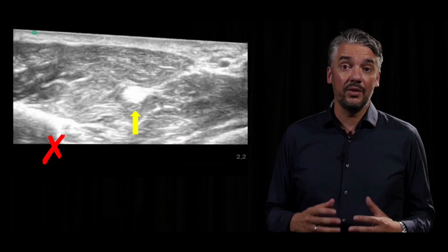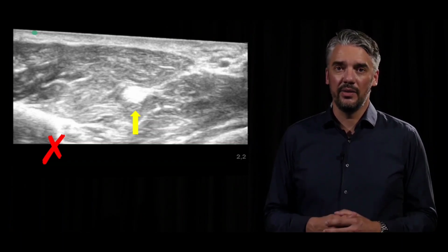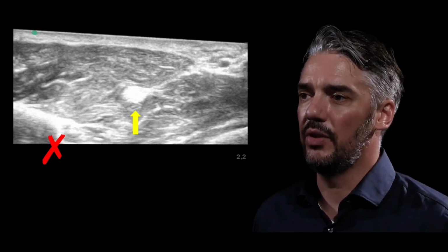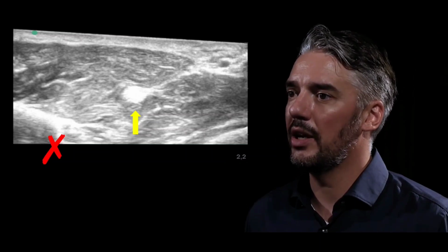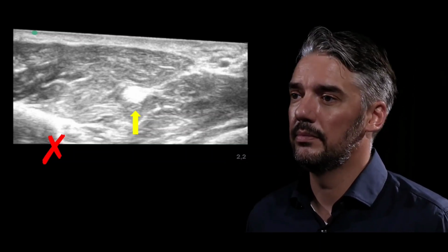Due to an excess value for the gain, the entire image turns white. This results in loss of intra-tendon architecture visualization. Also, it obscures all hyperechoic details because everything turns white as well.